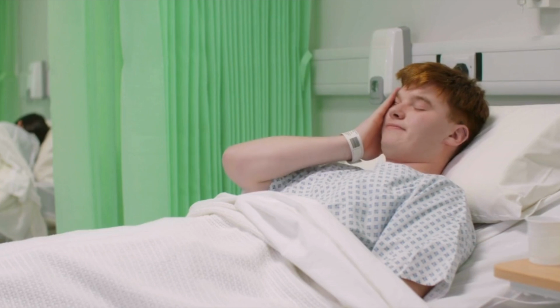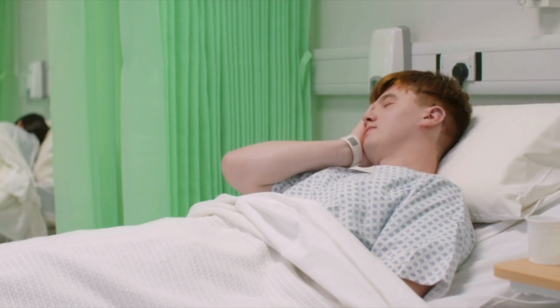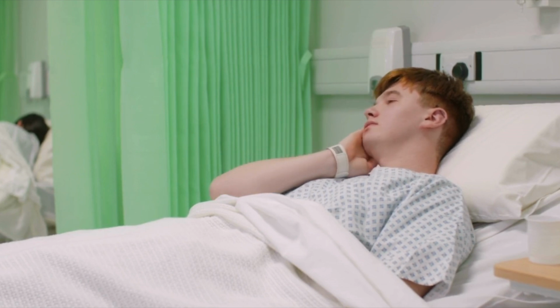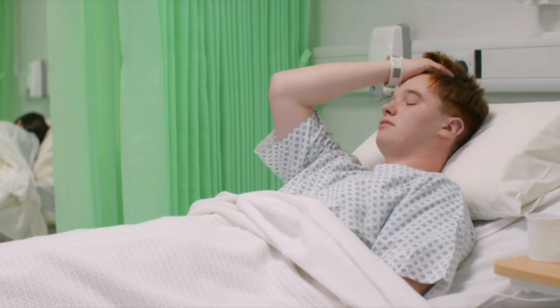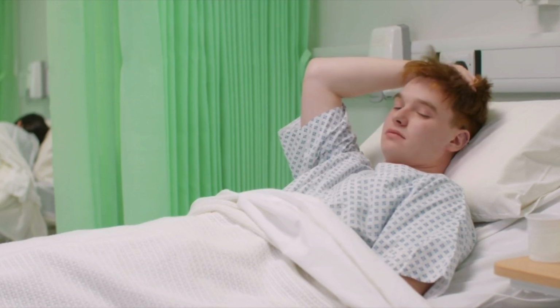Preparing for X-rays is quite simple. Patients might be asked to change to a hospital gown if needed. They should avoid wearing jewelry or clothing with metal fasteners because this can interfere with the images taken. And then healthcare providers should always ask about any previous X-rays, current medications, or if the patient is pregnant or breastfeeding before performing an X-ray.